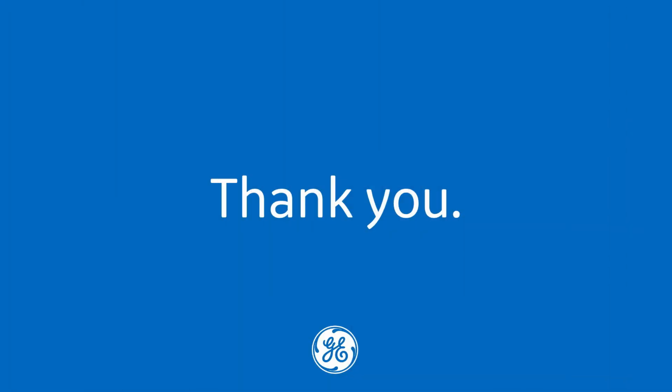Thank you for that insightful presentation, Dr. Adamsen. The key points we should all remember are: implementing cardiac PET imaging is often up to the radiopharmacy's ability to implement new production batches. 13N ammonia is a tracer of choice, although it is labour-intensive. Utilisation of a multi-run purification module helps production workflow along with the imaging schedule. And, as with every new PET tracer, a comprehensive implementation is required and takes several months before starting clinical use.